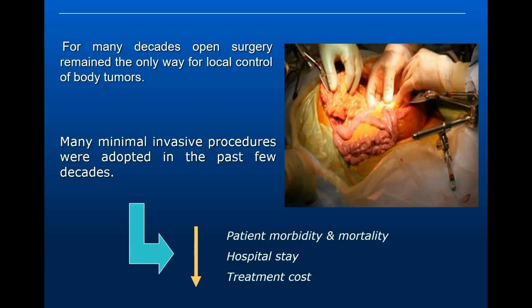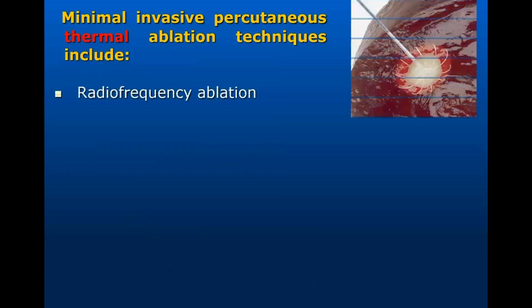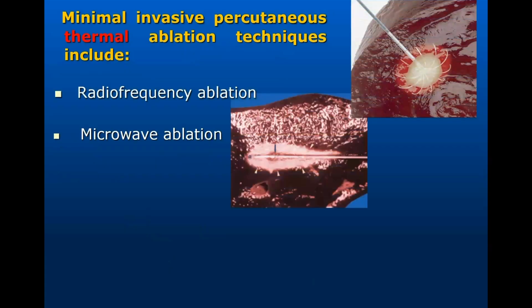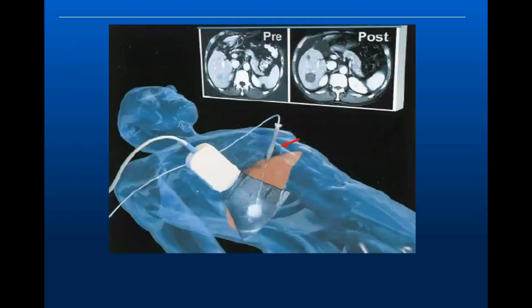modern oncology practice. So as I mentioned before, today we'll talk about the minimal invasive thermal ablation techniques. Basically, we'll cover radiofrequency ablation, microwave ablation, cryoablation, and HIFU. Again, the beauty of all these modalities is, as I mentioned before, you can deliver all these energies with a very small probe that can go in through the skin into the tumor.